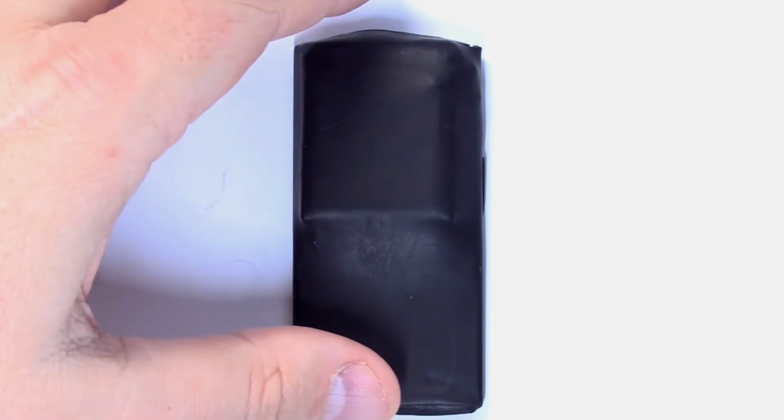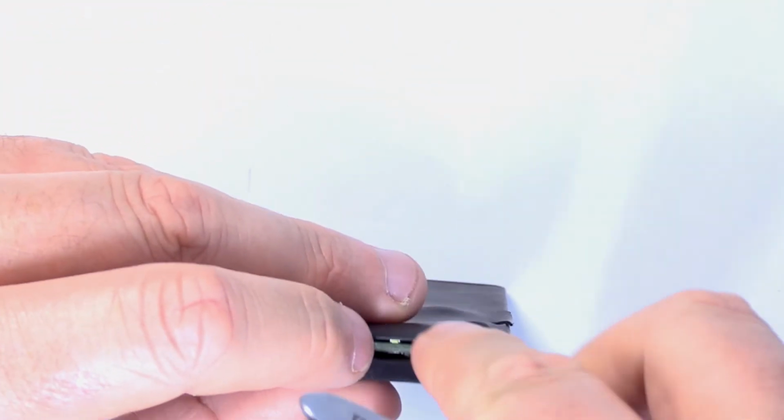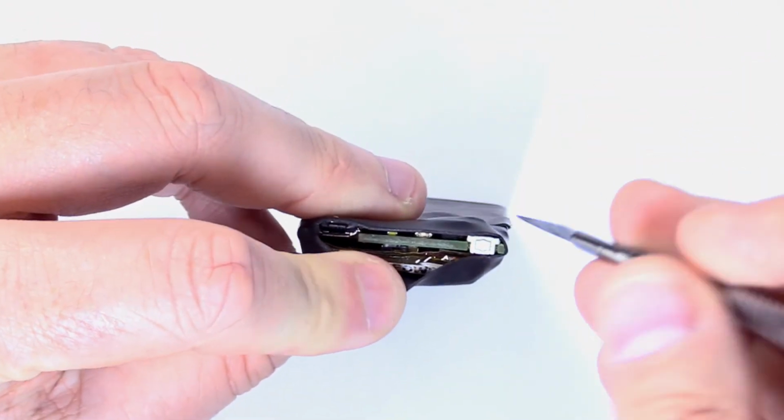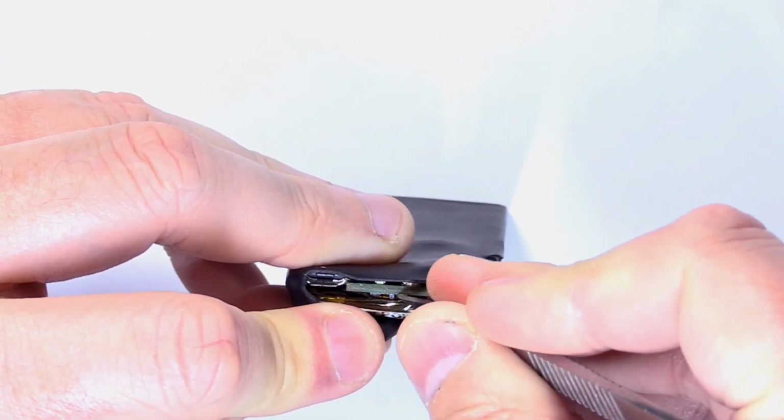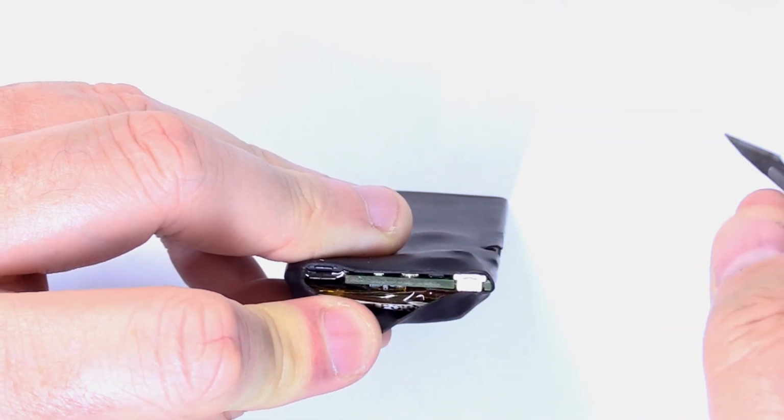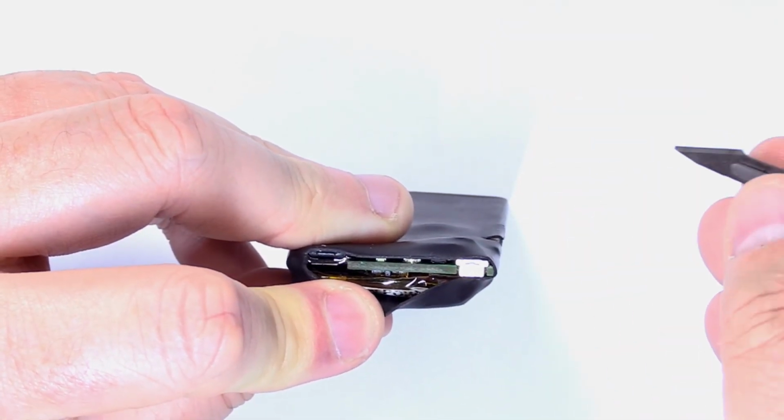The power switch is located underneath the battery and may be accessed with a small screwdriver. To disconnect Second Sight from the battery, move the switch to the far left-hand side, nearest the USB port. To connect Second Sight to the battery, move the switch to the far right-hand side, nearest the white standby button.